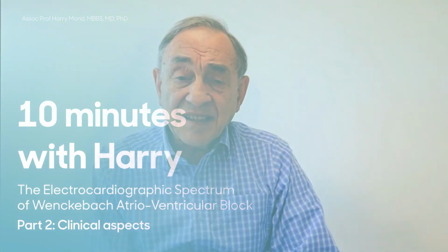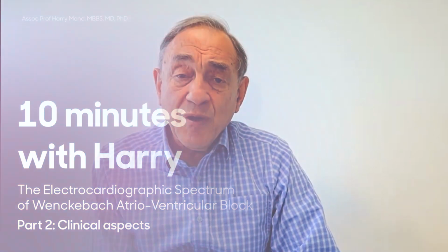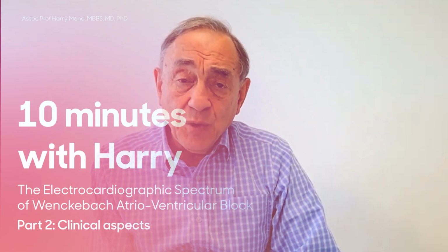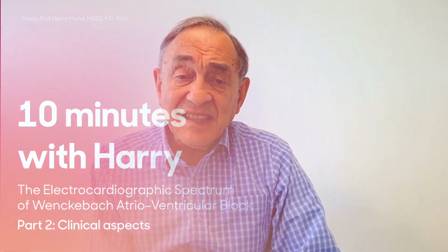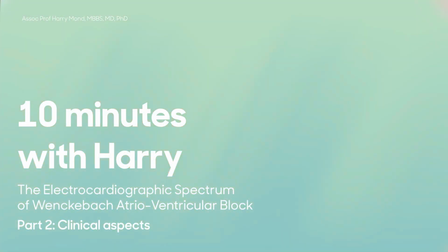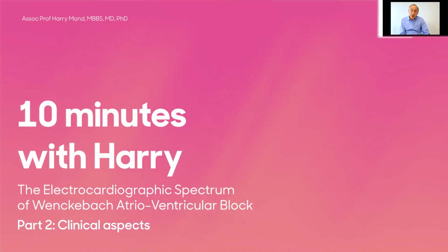We recently discussed Wenckebach AV block and the footprints, how we recognise it on the ECG. Today I'd like to continue with Wenckebach AV block and discuss some of the clinical aspects, how they relate to the electrocardiograph. The electrocardiographic spectrum of Wenckebach AV block. And today I'd like to talk about the clinical aspects as it relates to the electrocardiograph.